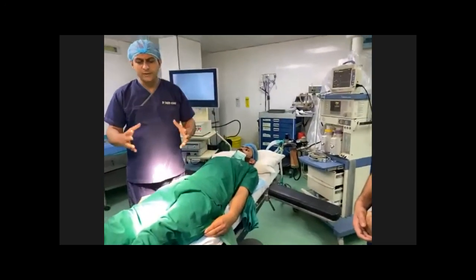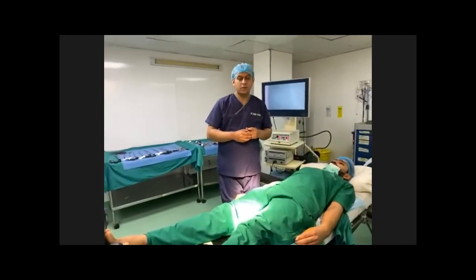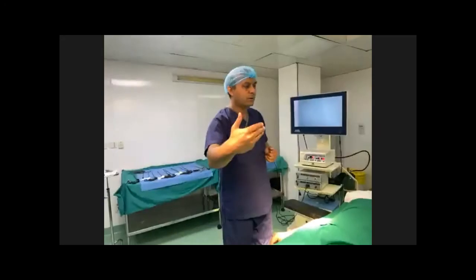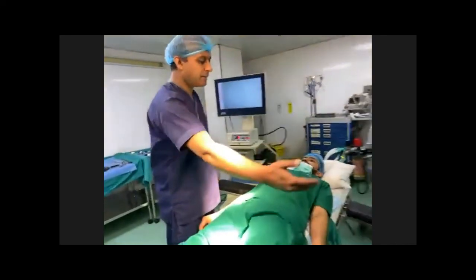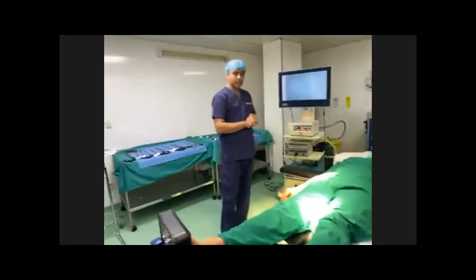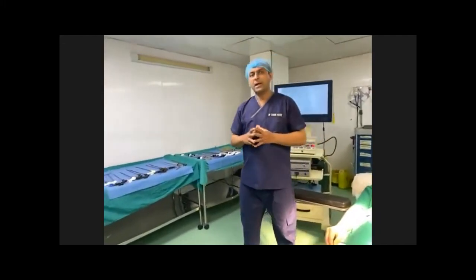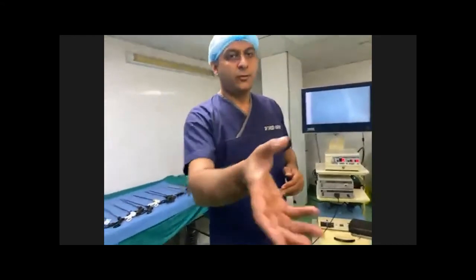So I am giving a brief account of different positions in the routine procedures which we are performing. In the advanced procedures, there are different things. For example, in bariatric surgery, you are standing in between the legs, the cameraman is on the right, the person retracting the liver is on the right of the patient, and your first assistant will be on the left of the patient. And the same is the case with colorectal cases and upper GI cases, with different techniques. So this is a brief account of patient positioning, and we can discuss it at the end, with a few questions and answers.